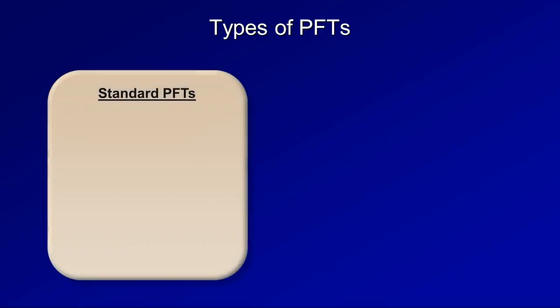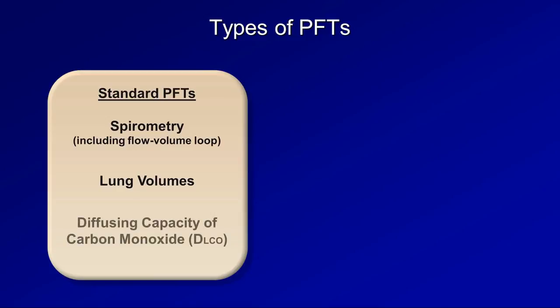First are the standard PFTs. This includes spirometry, which is predominantly a measure of airflow. There are lung volumes. And there is the DLCO, which is largely a measure of the integrity of the alveolar capillary membrane. Typically, when a physician, nurse, or respiratory therapist mentions the term PFTs, this set of three tests is usually what he or she is referring to.